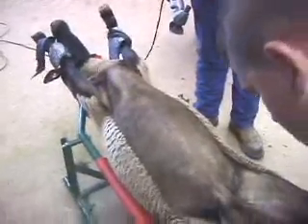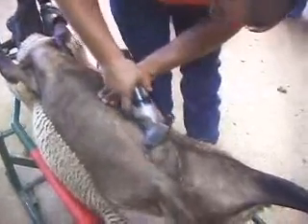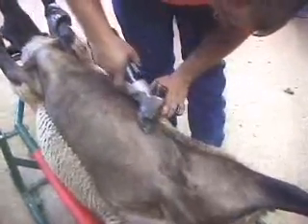The following videotape is a demonstration of laparoscopic artificial insemination in the ewe. The ewe is first placed in a cradle in a dorsal recumbent position.